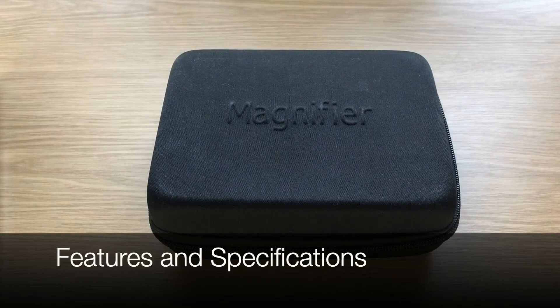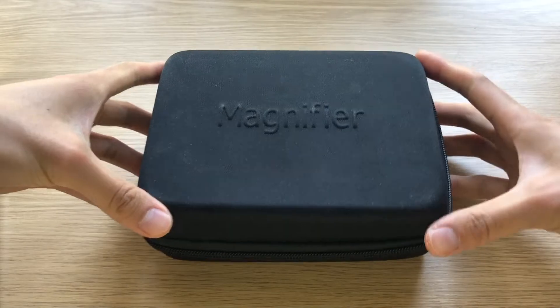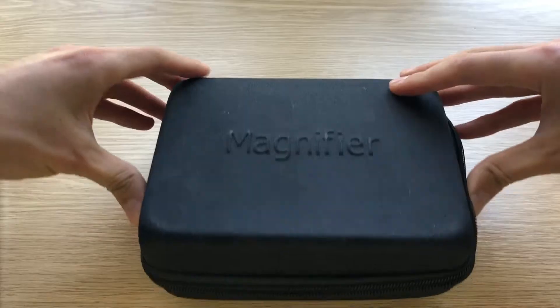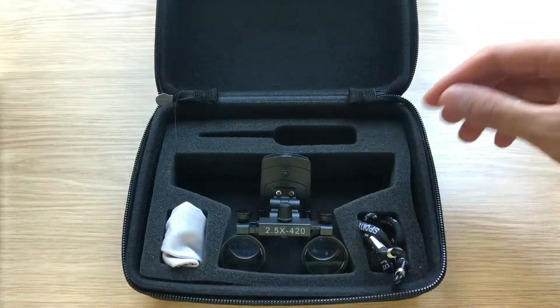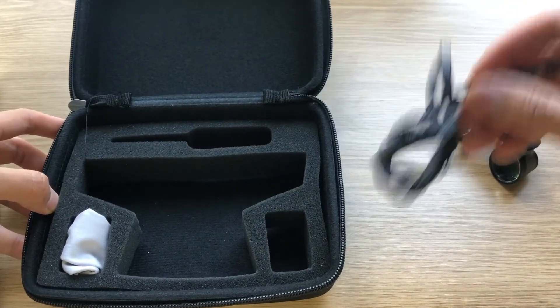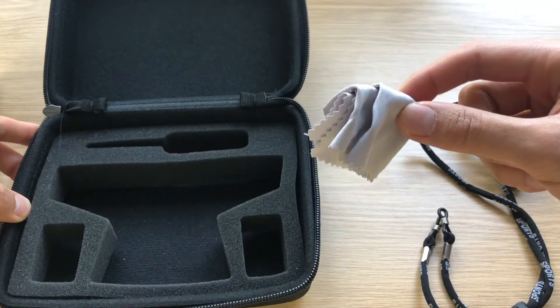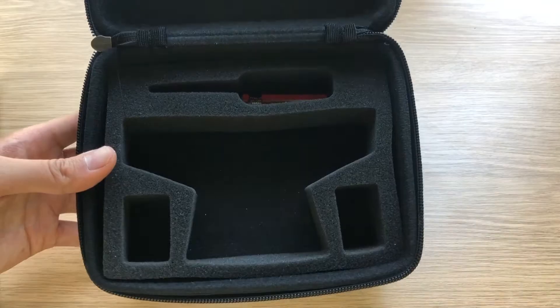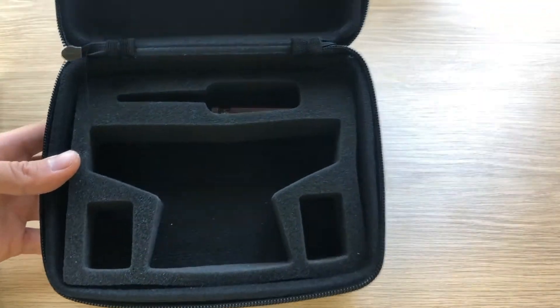So let's look at the packaging. The loops come in this nifty box as a protective case. Inside you have the clip-on loops themselves, some straps for your glasses, a microfiber cloth, and they also come with a screwdriver. It's good to have a protective case — it's a little bit on the big side, but it does do the job.